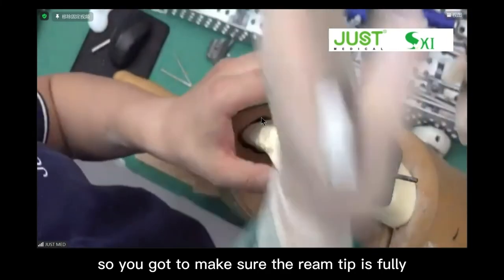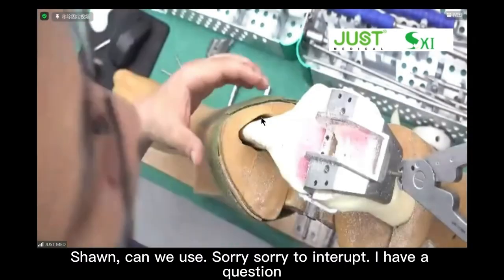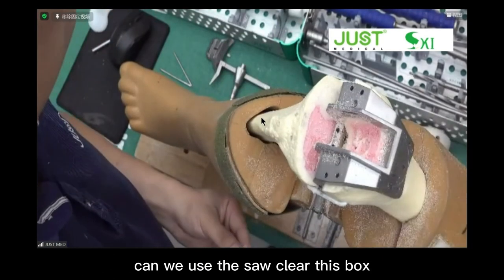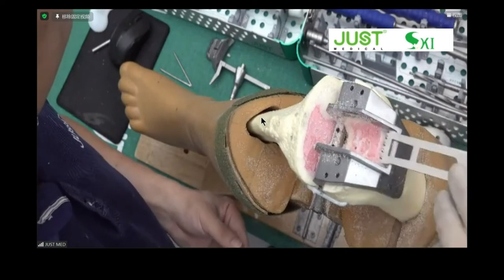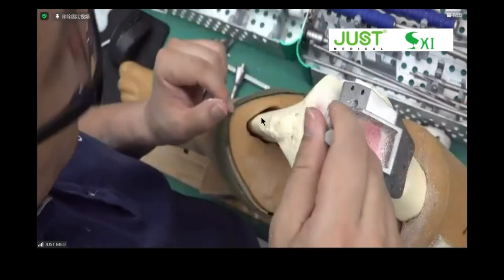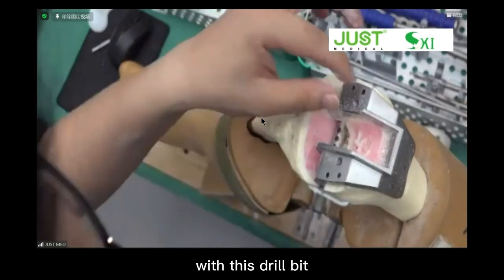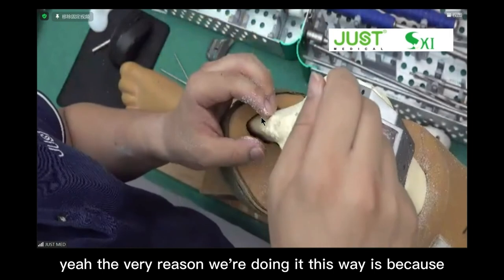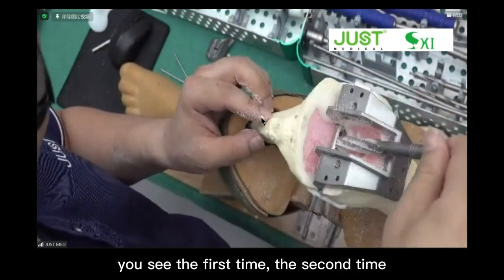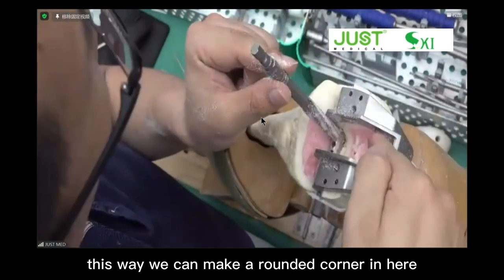So you've got to make sure the reamer tip is fully seated in the PS box mill pivot. Sean, sorry to interrupt you, I have a question. Can we use a saw to create this box? Yeah, you can do that. That will be quicker, but... What is the difference? Why are you doing it with this drill bit? The very reason we're doing it this way is because you see the first time, the second time. This way, we can make a round corner here.